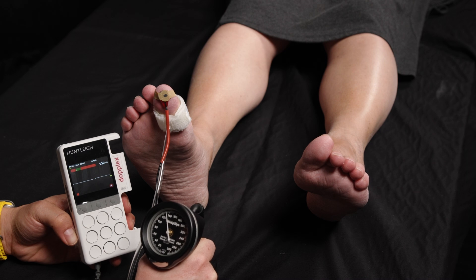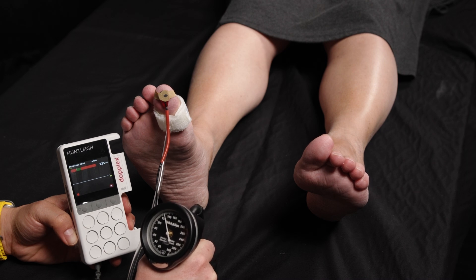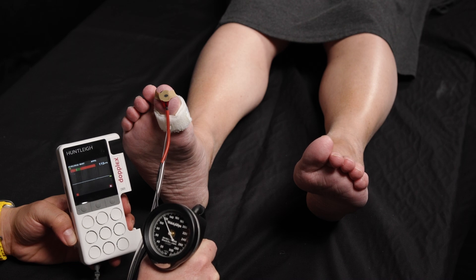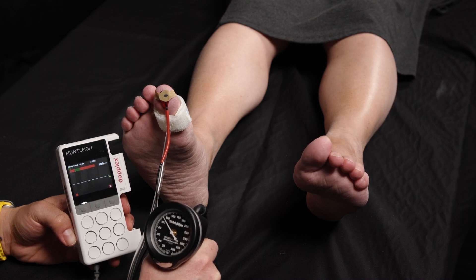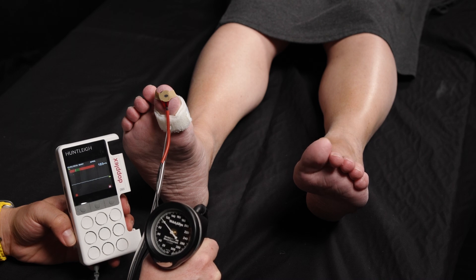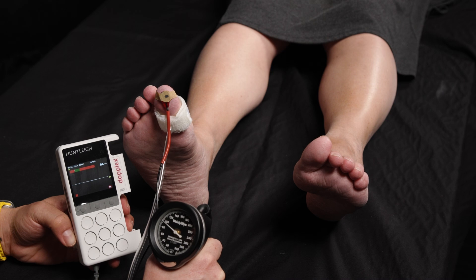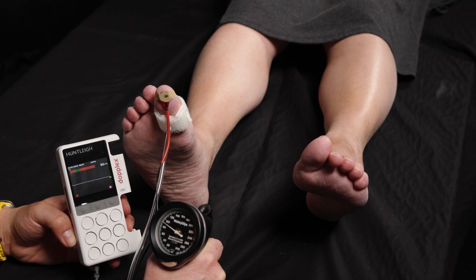We're watching very carefully, waiting for that waveform to come back in. Ideally, the toe pressure will sit around 97, 98, or even up to 100 or just over 100 — that's where a normal toe pressure would sit. Abnormal toe pressures are pressures under 60.